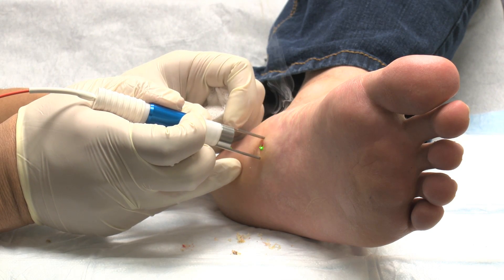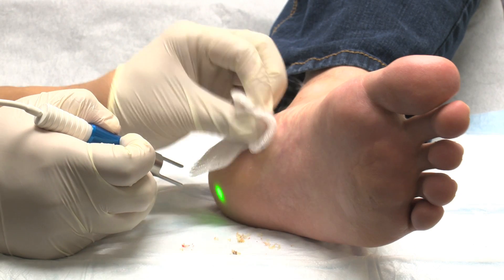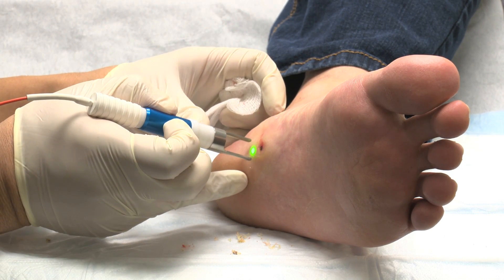Continue until the treatment area appears carbonized. If necessary, apply cooling such as a frozen gel pack in between lasering.